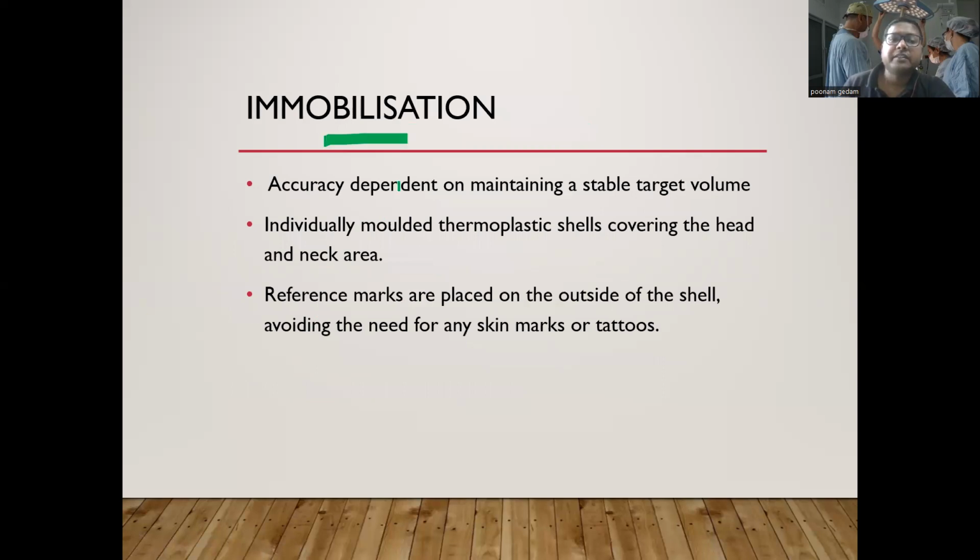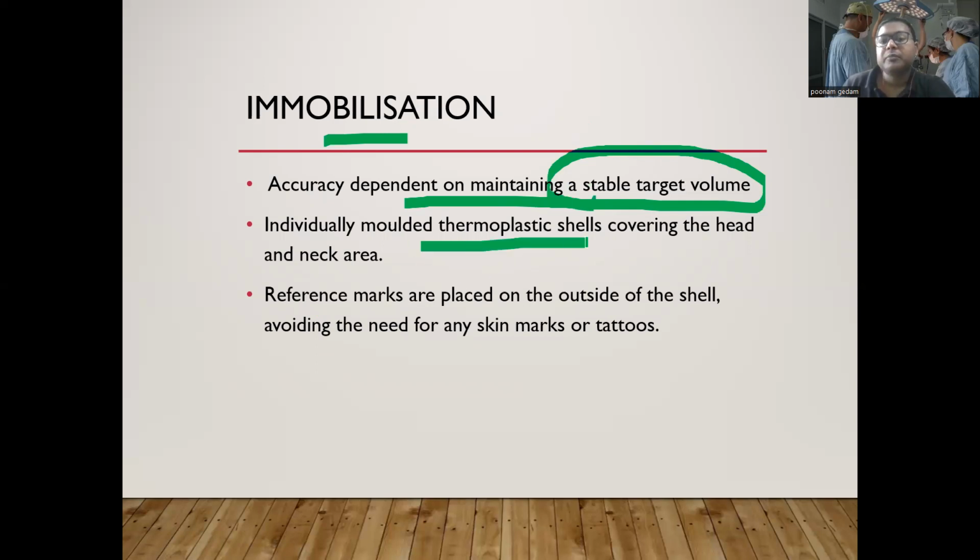So what is immobilization? Accurate treatment depends on maintaining a stable target volume. Individually molded thermoplastic shells covering the head and neck area are used. Reference marks are placed on the outside of the shell, avoiding the need for any skin marks or tattoos.